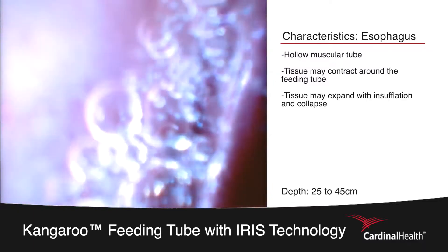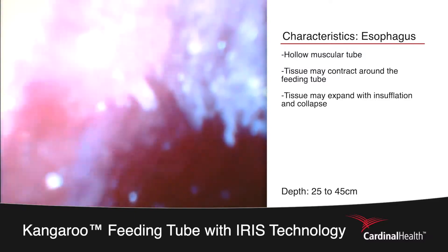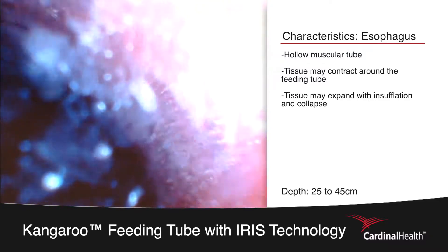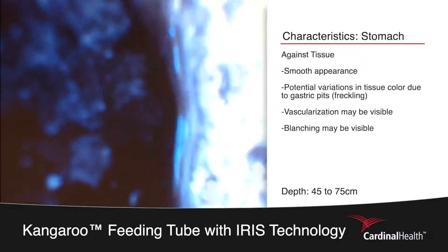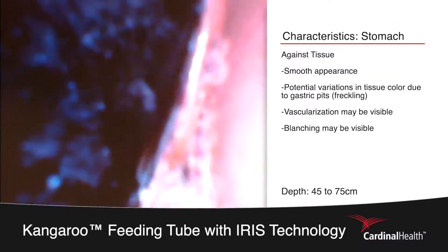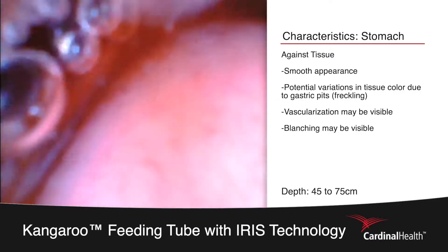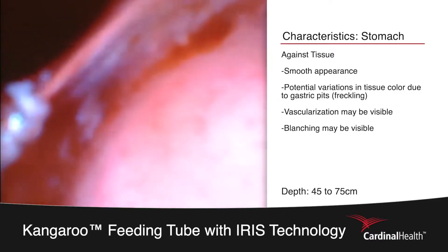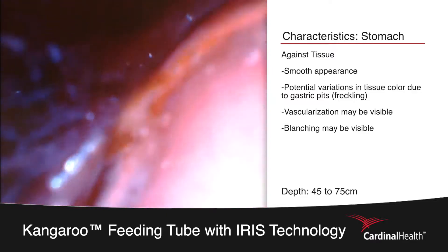Once we have determined that we are in the esophagus, we will continue to progress down to around the 50 centimeter mark. We will be looking for the cavernous structure of the stomach and those large irregular rugal folds. The tissue of the stomach differs from that of the esophagus, which can be easily visualized by the smooth tissue and the presence of gastric pits, which resemble freckling.